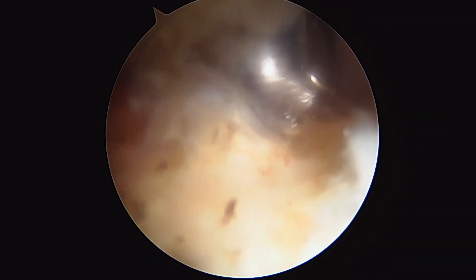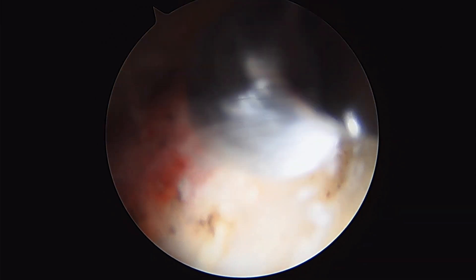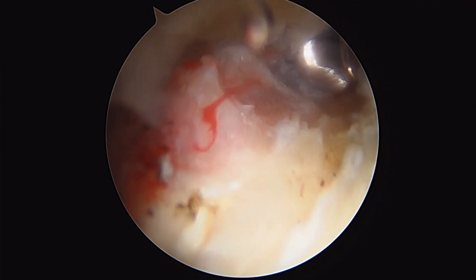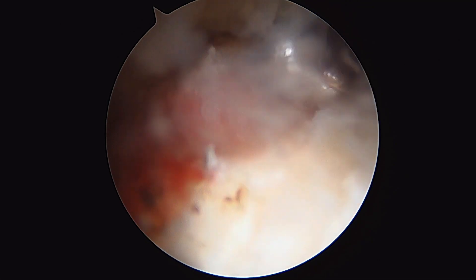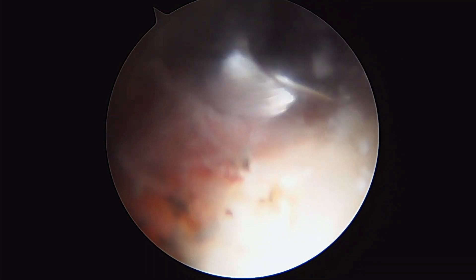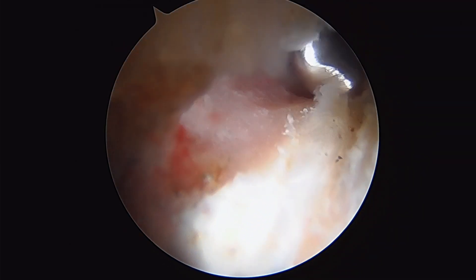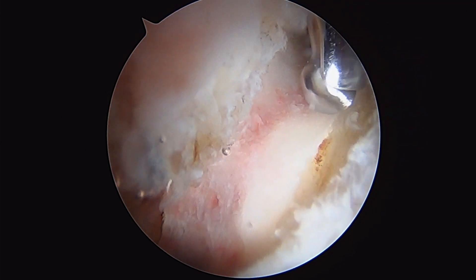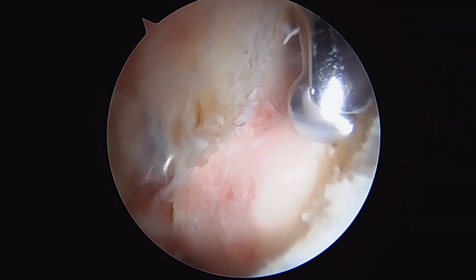Now I'm going to work my way laterally here. Here's the second lesion. See the amount of bone we're taking away here. I'm just making my last finishing touches along the acetabulum.